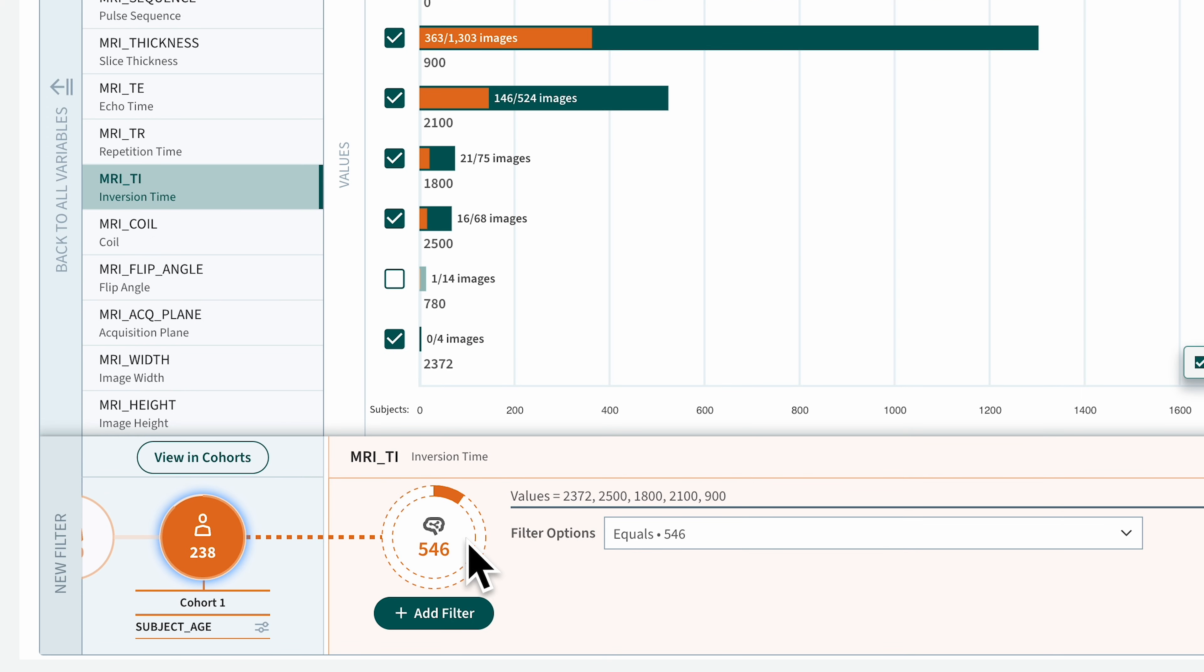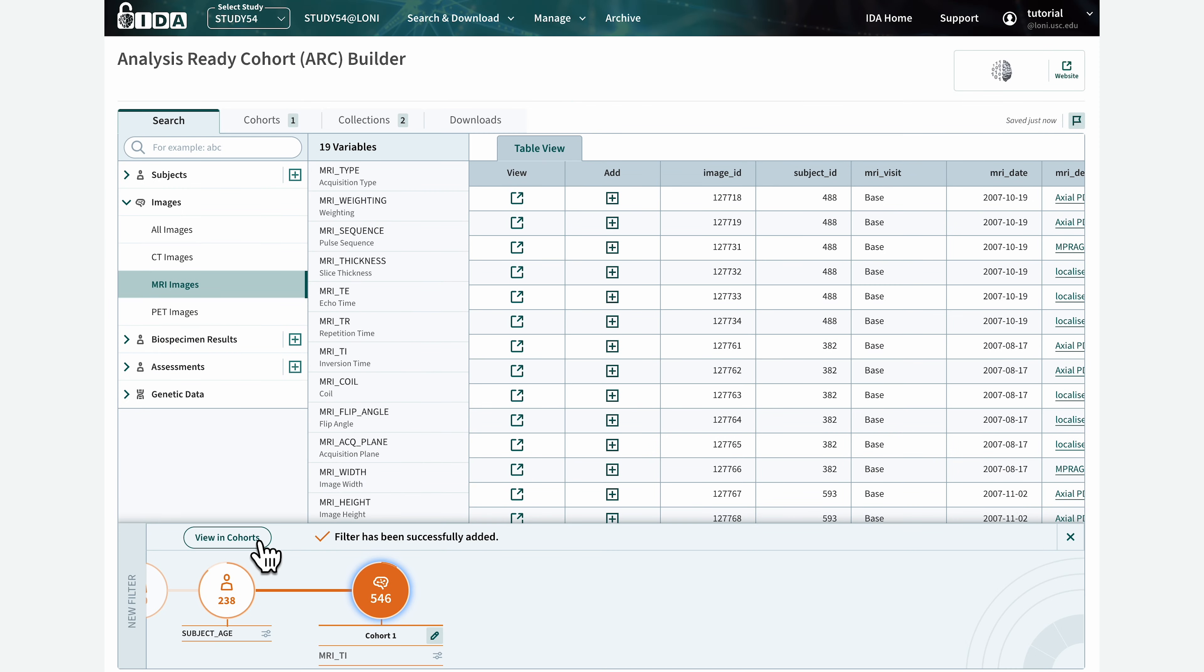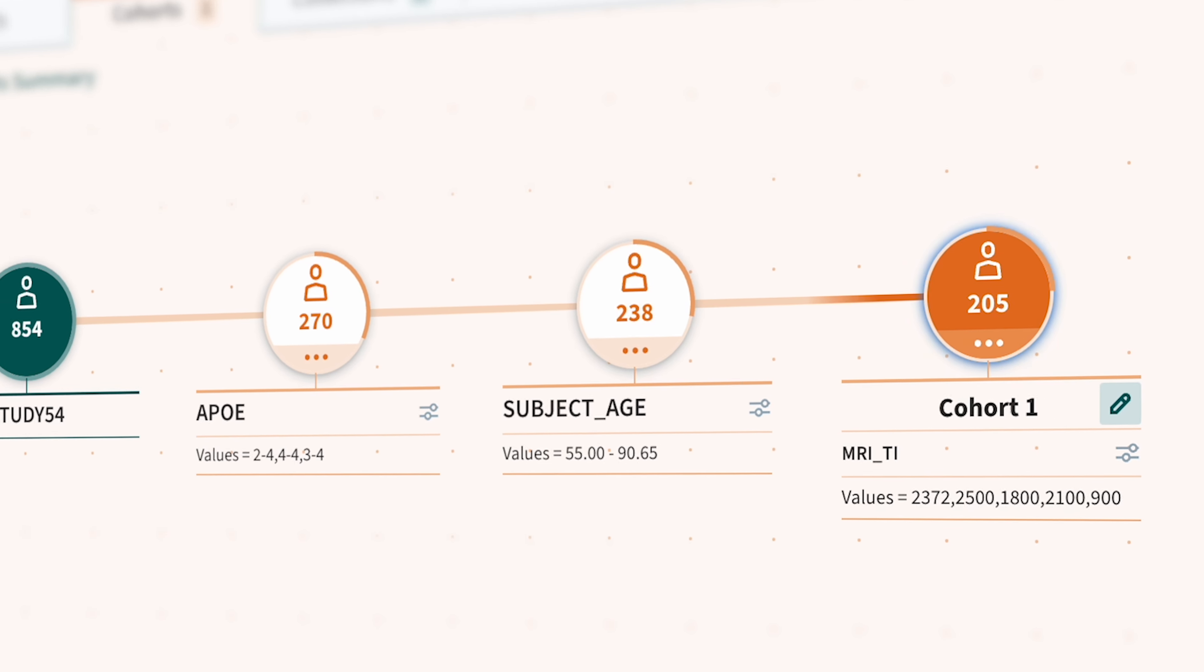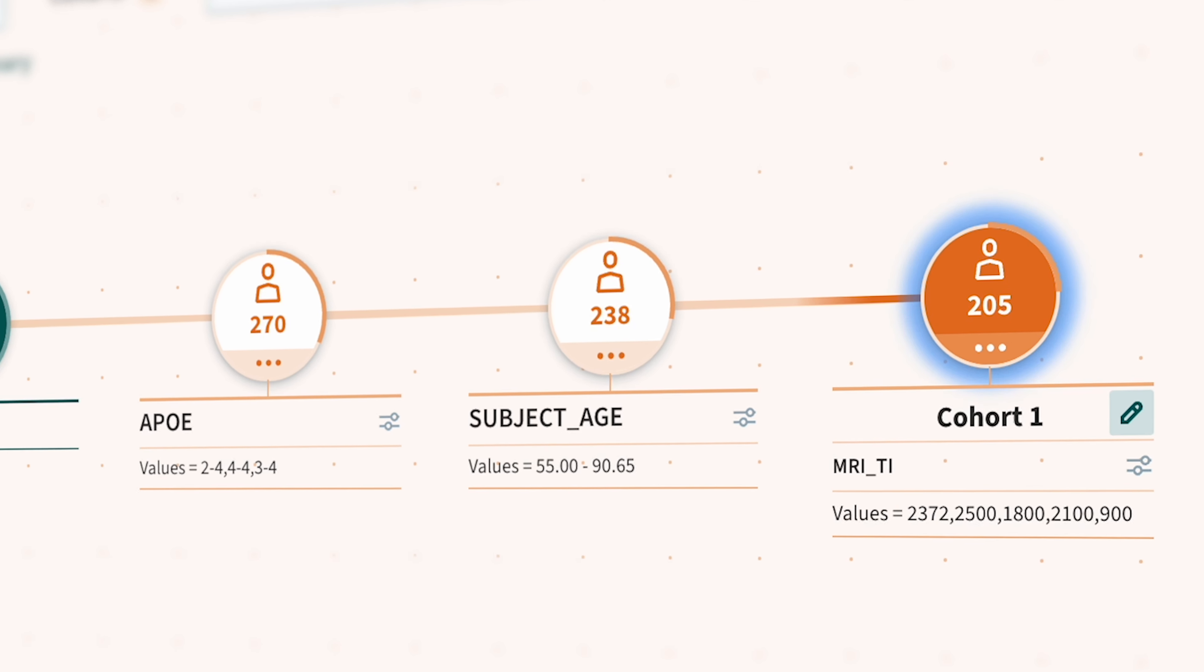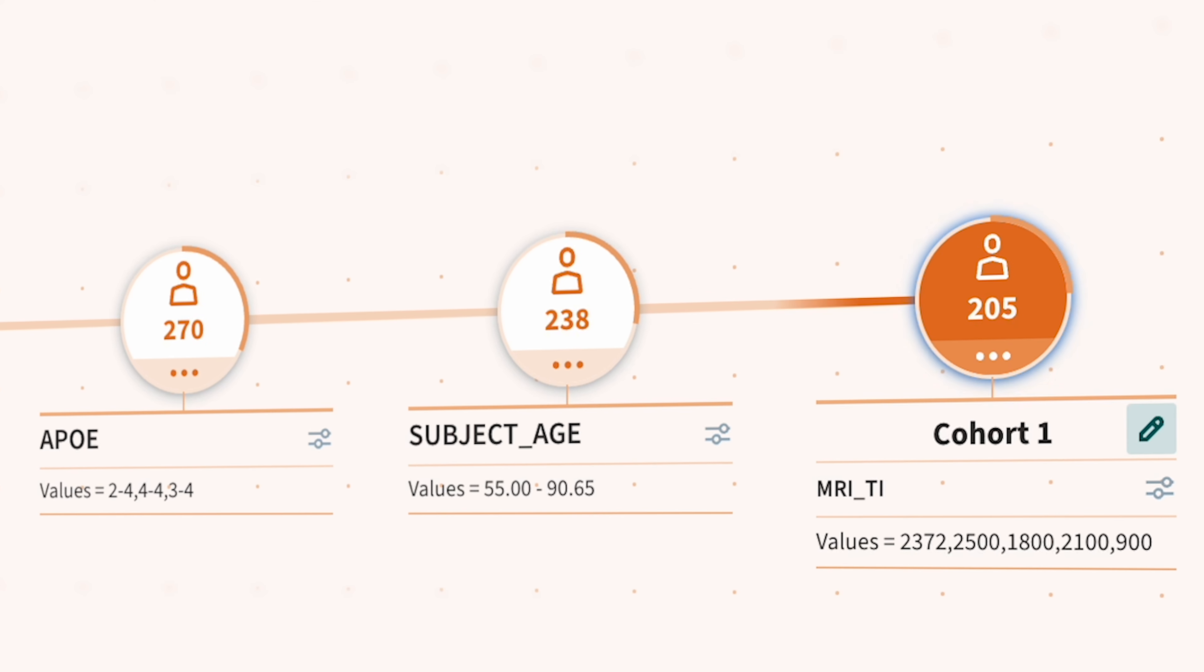As we can see, there are only 546 image scans for the 238 selected subjects from our cohort. Create the filter by clicking the Add Filter button at the bottom. This reduces the number of subjects in the cohort to 205 subjects.